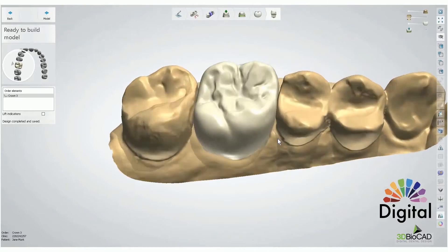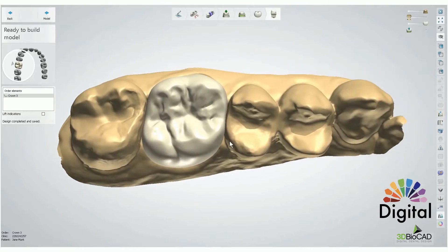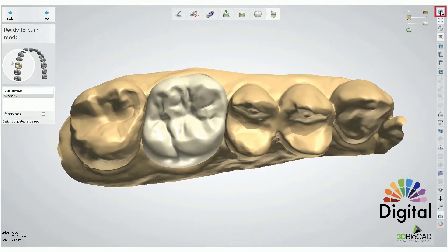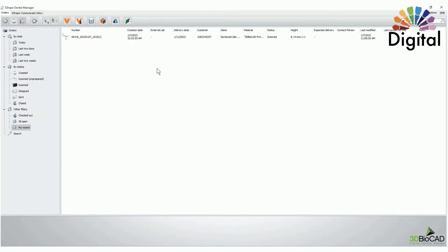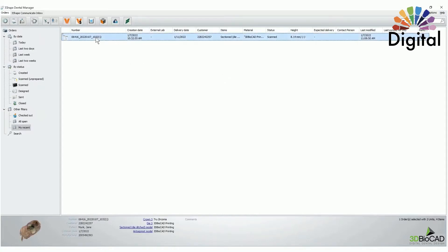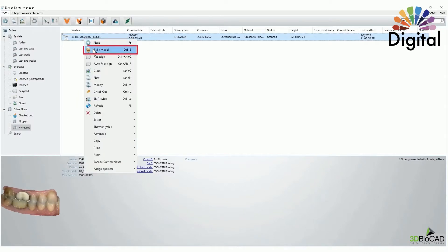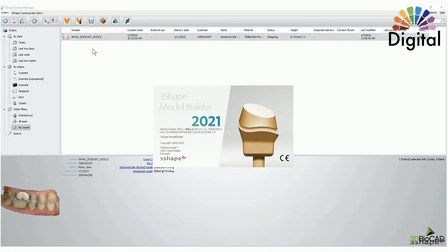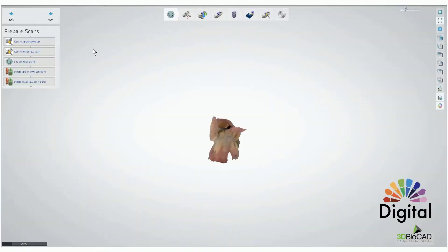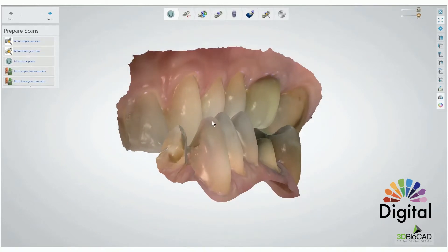Once we're done with the crown design, we can get into model build. At the end of the crown design page, we have a model button you can click, or you can exit out and click the model build button later. The crown design is already done and it's ready to do model build. Now we are in Model Builder, which is going to be simpler than the crown design.